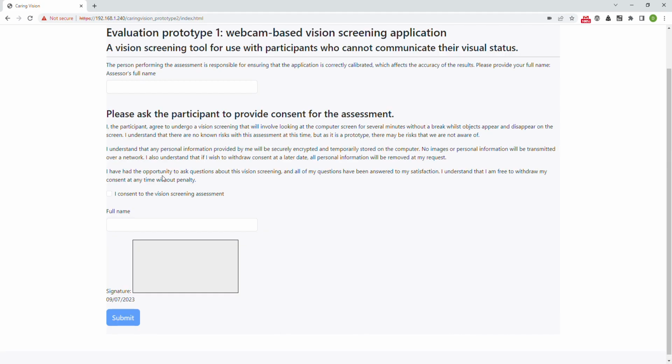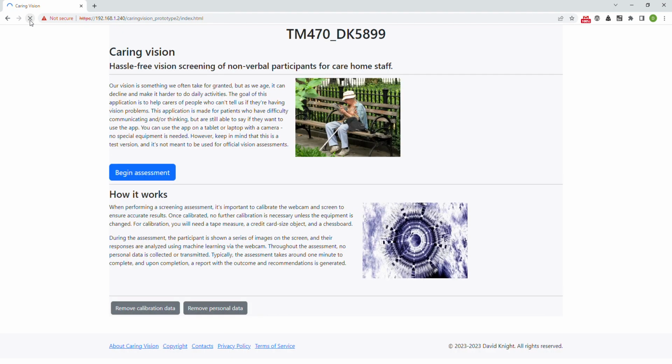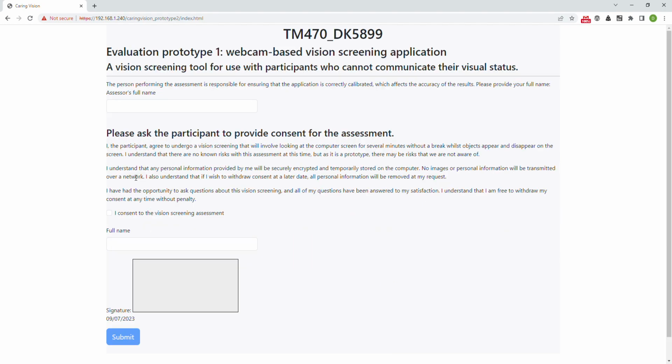So we're now calibrated. So now we have the screen calibrated and the webcam calibrated. Now, although I can continue at this point, I'm going to just reload because I want to show you that that process only needs to be done once. So now we go back to the main screen again. Calibration data down here is now saved, and I can now begin an assessment, and it takes me straight back to the previous screen because all the previous steps have been completed.